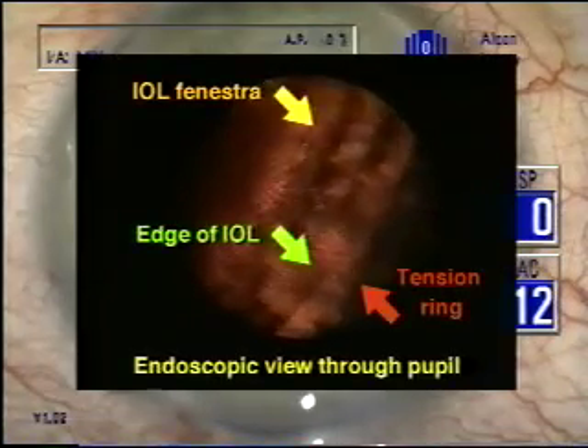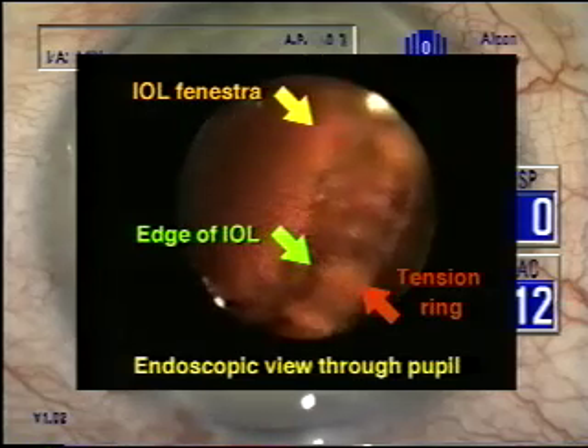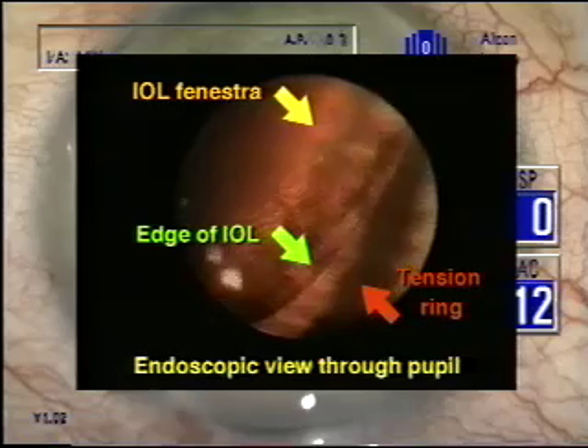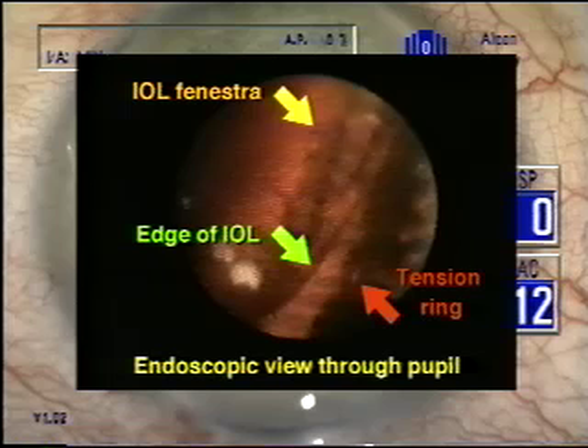We are using an endoscopic camera here to demonstrate that the edge of the lens and its sides are well away from the endocapsular ring, and the capsular bag will maintain its circular shape.